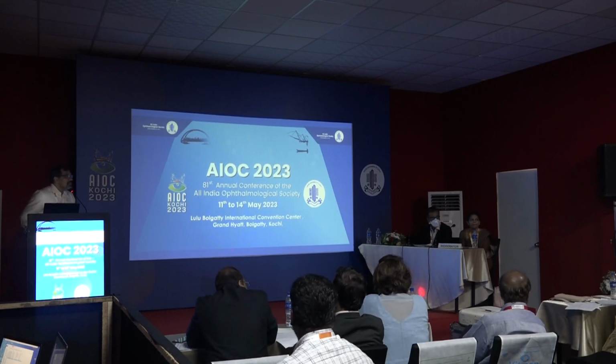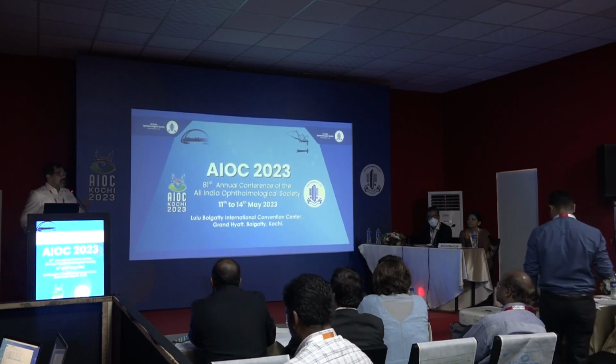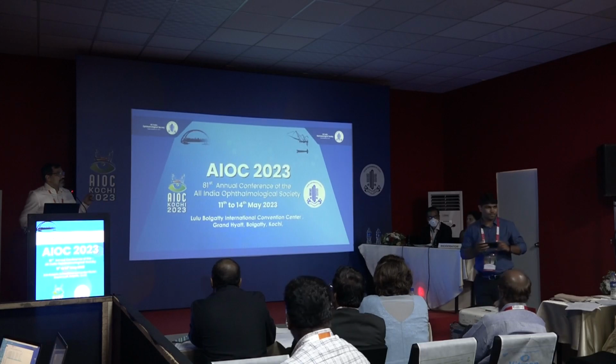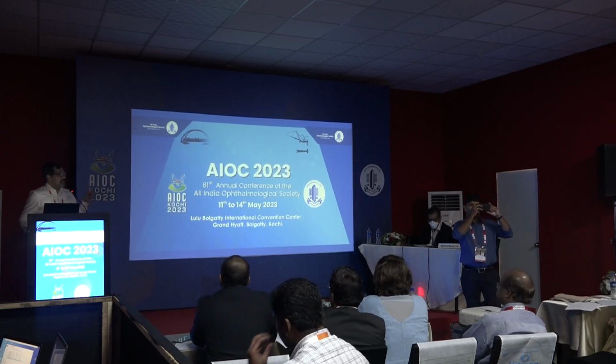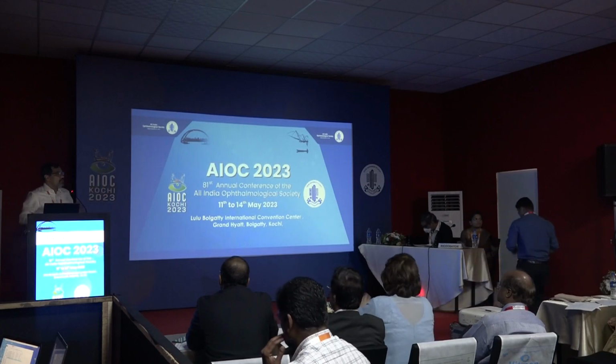What is the cost? Sir, we are developing two more things in this system. That P2 with infrared light, we will find out the total TK. We will find P1 and P2 and SDR mode too. So the blood vessel will be more prominent.